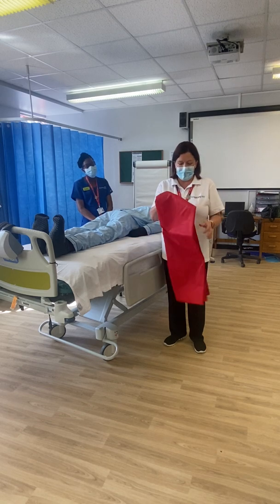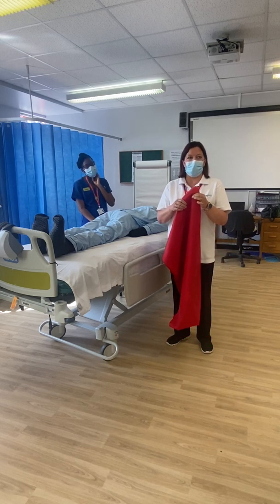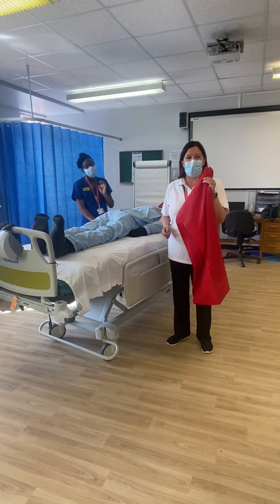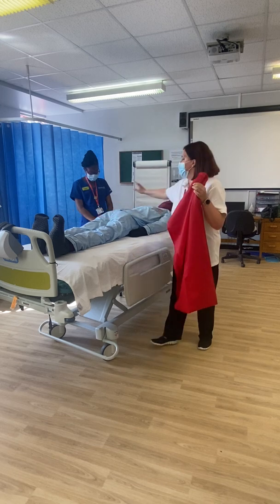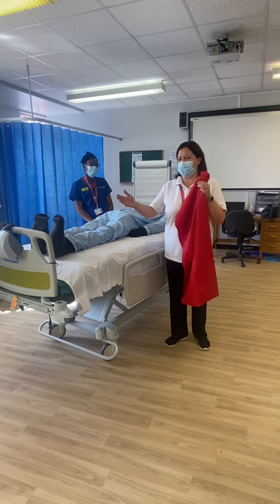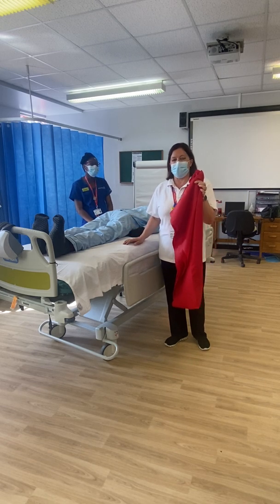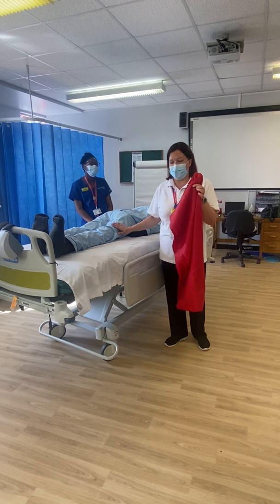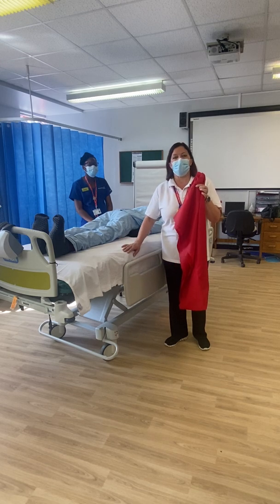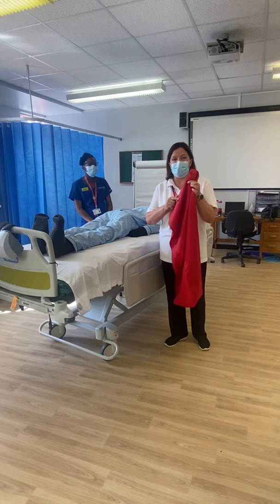This particular slide sheet is the size of a single bed, and that's because it's really important that the entire patient is on this, from the tip of the toes right to the top of the head, because that way all of the bony areas of the patient is on there, which will help minimise that pressure damage. And this slide sheet goes directly under the patient. It does not go under the sheet, because if you did that, that would mean that you were then using the sheet to effect the transfer. So it goes directly underneath the patient.